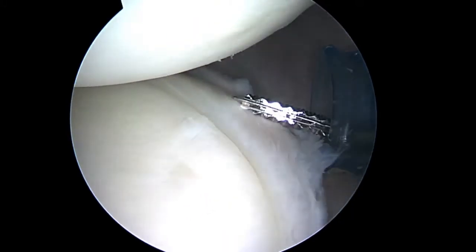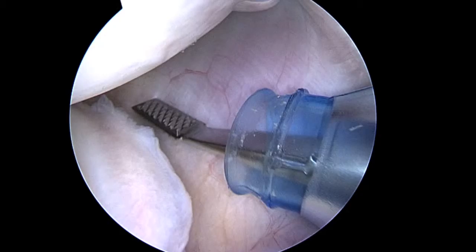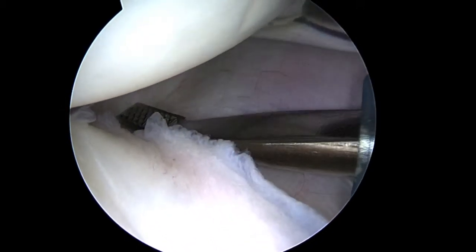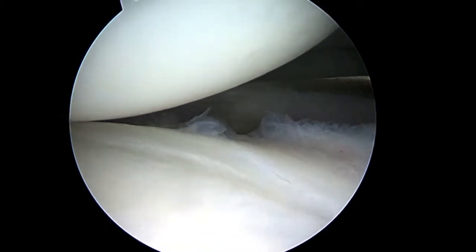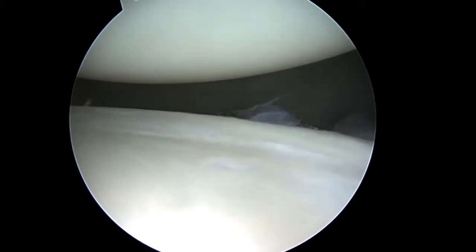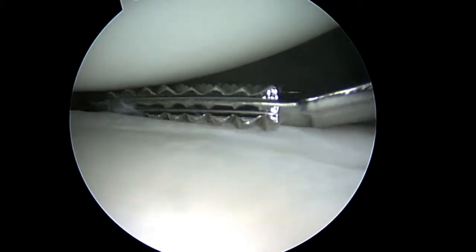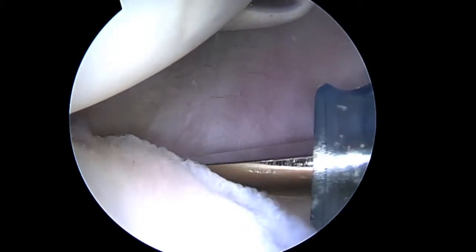So now we're looking from the front to the back — let me give you the overall view. You can see how this does look a lot looser than it was before. We're going to use an instrument called a rasp just to roughen up the capsule back here. We're going to use an anchor down here because we're worried that the labrum by itself is a little bit thin — it may not give us enough fixation. With this instrument, we're just trying to roughen up the capsule, not trying to make any holes, just to give us enough of a healing response that it'll heal. And that's the labrum there that we're touching.